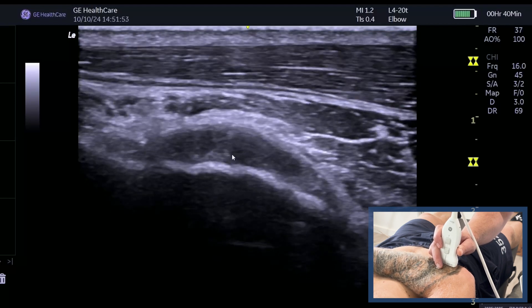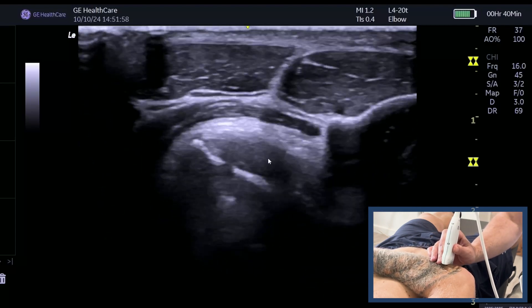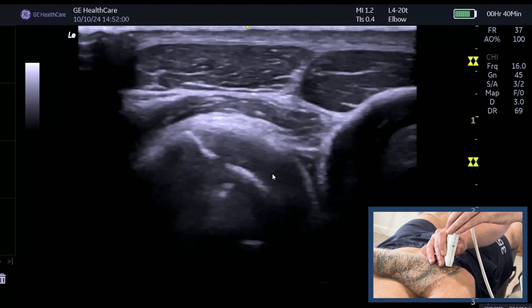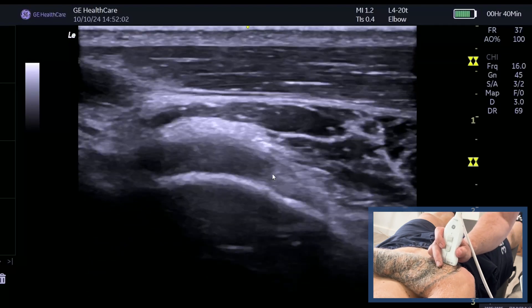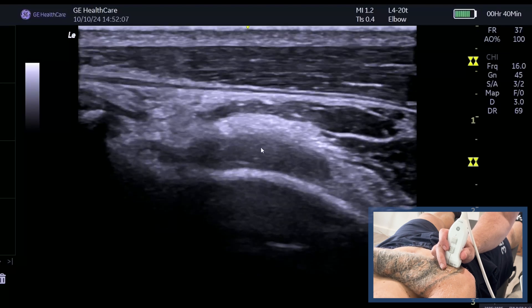The key takeaway here is that while many of you will be good at finding the long section, if you just rotate on that position, you get a really nice transverse footprint of the distal biceps onto the radial tuberosity.